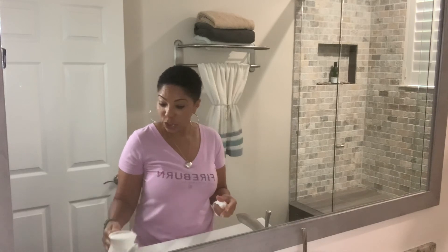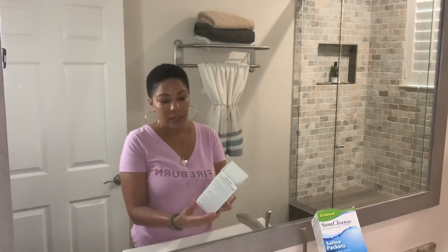After that, take your neti pot and clean it very thoroughly with a nice soapy solution, then put it aside to dry. You have your SinuCleanse saline packets — you can follow the directions or go online to create your own saline solution — but I found this works best for me. Other solutions I've made on my own have really burned. If you want it more saline, use another packet; if you want less, use half. And that's how you use a neti pot.